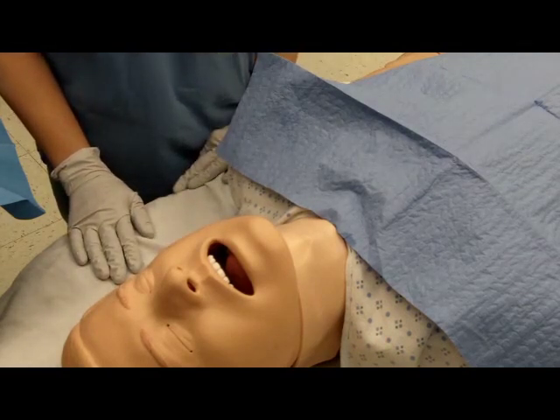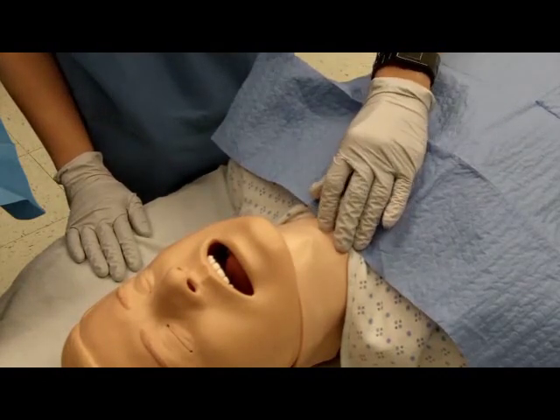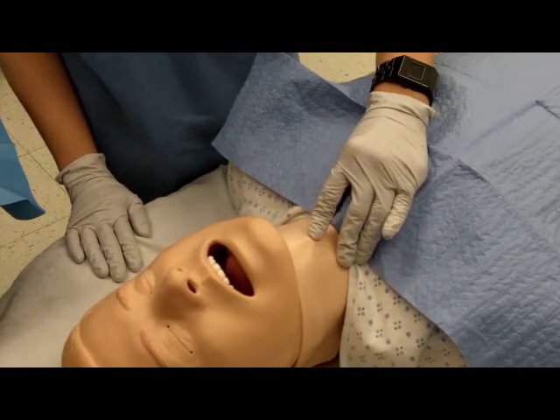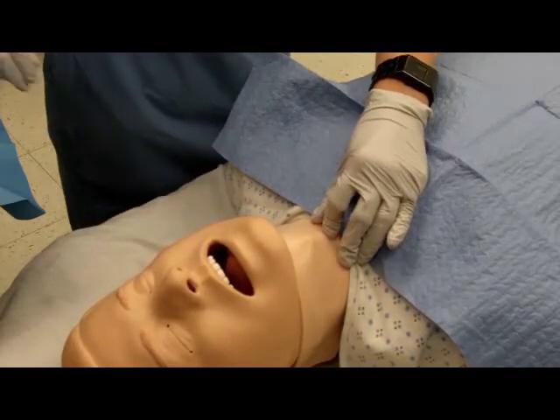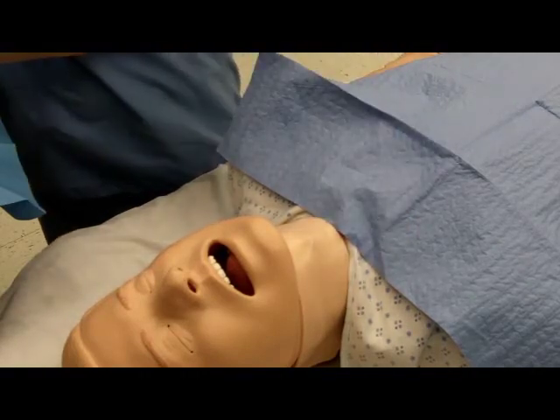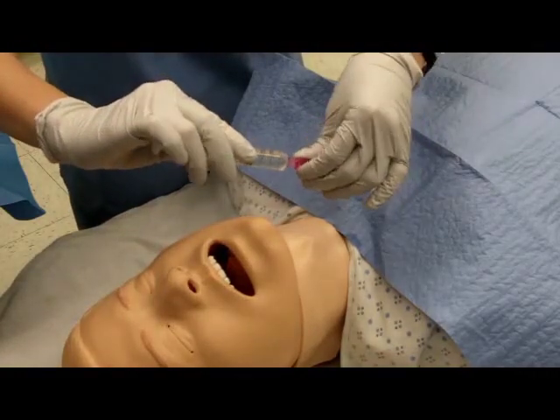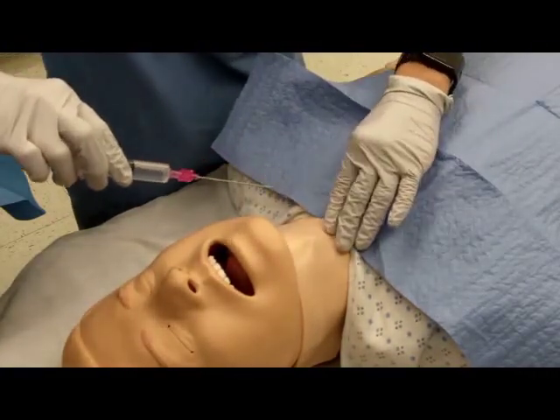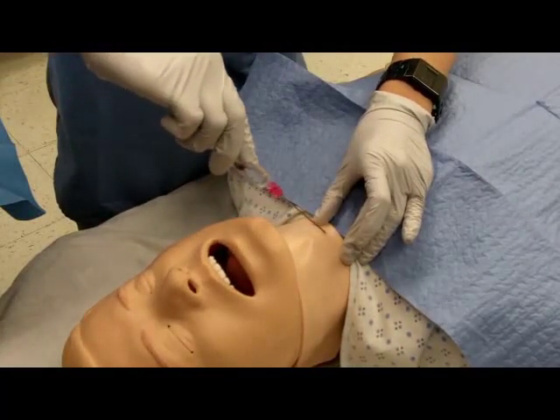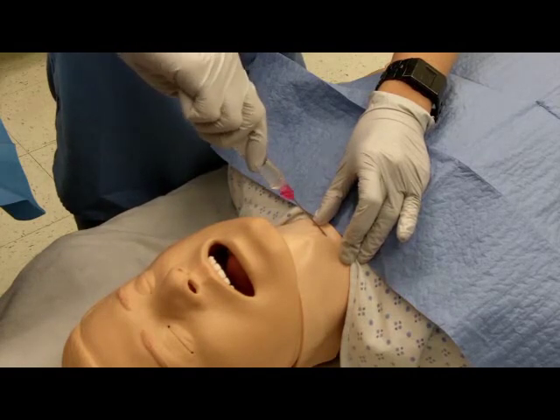Palpate the cricothyroid membrane with the non-dominant hand while immobilizing the larynx with the thumb and the middle finger. Attach the introducer needle to a syringe half filled with water. Insert the needle at a 30 degree caudal angle while applying negative pressure on the syringe.